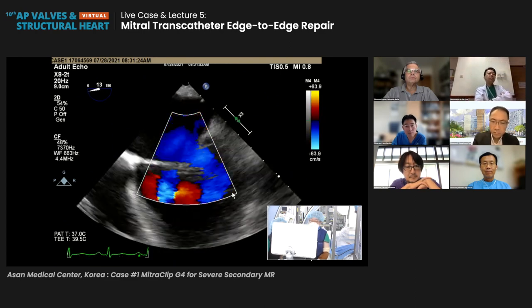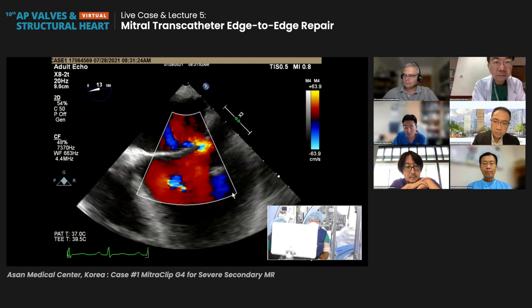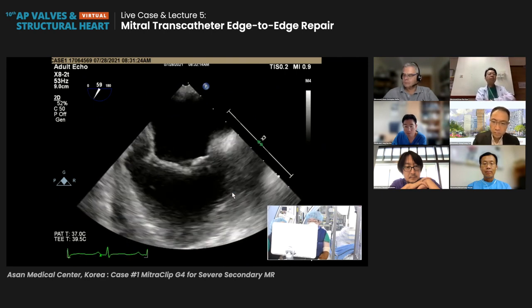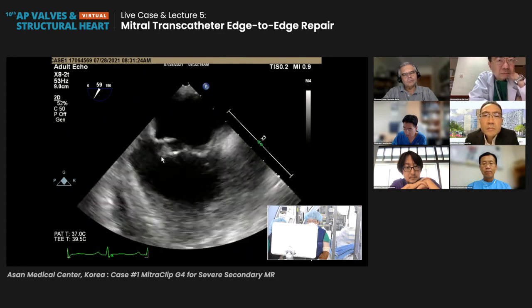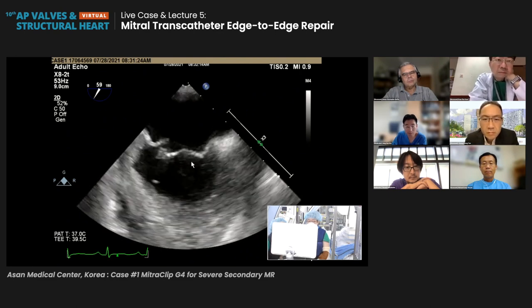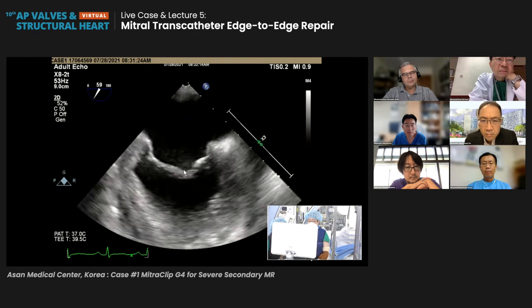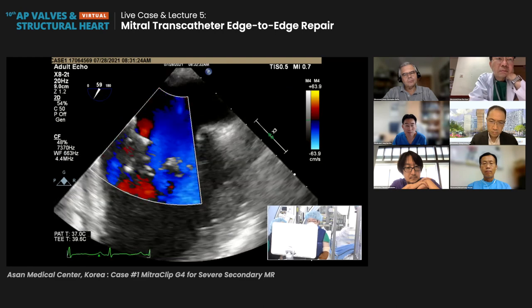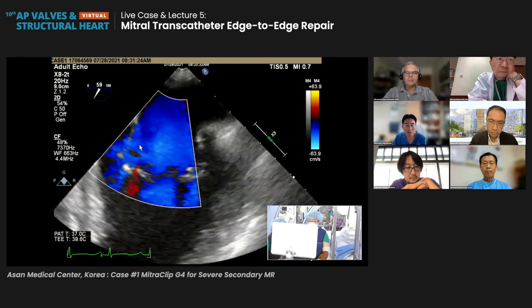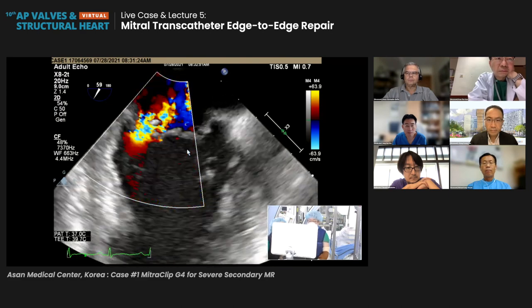As you see in the TTE finding, the patient initially had ischemic MR. After that, the dyspnea aggravated due to chordal rupture of the A3 portion. In the bicommissural view, you can clearly see the A3 portion chordal rupture, which may involve a slight commissural part, and then a relative prolapse portion of the A2, and maybe extreme tethering of the posterior leaflet and relative prolapse of the anterior leaflet causing ischemic MR. In color flow imaging, you can clearly see a big jet in the A3 chordal rupture portion and multiple jets in other areas. We are focusing on the A3 portion. You can see a big jet in the ruptured chordal A3 portion.